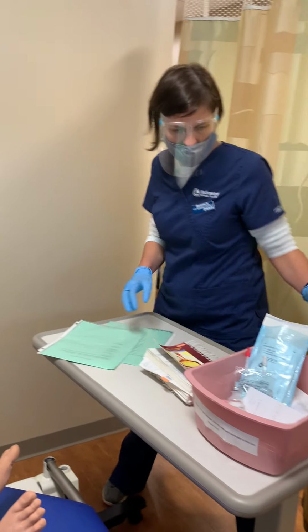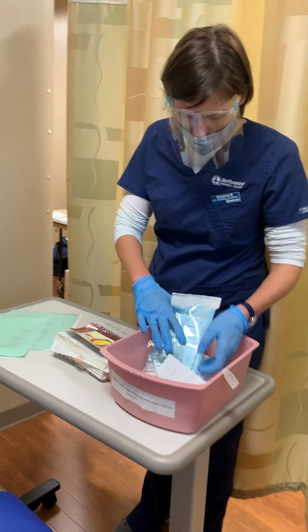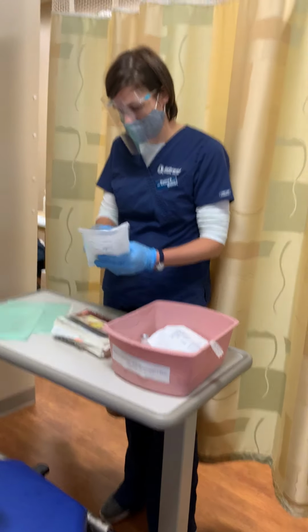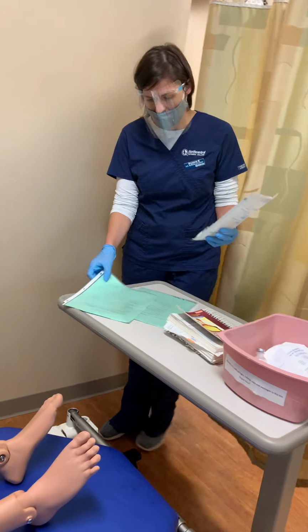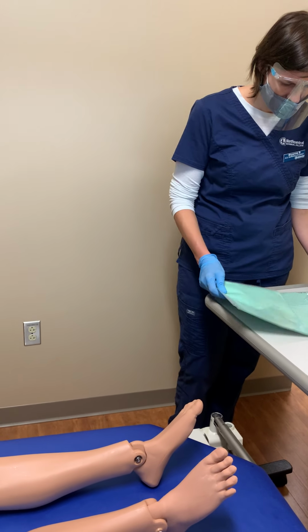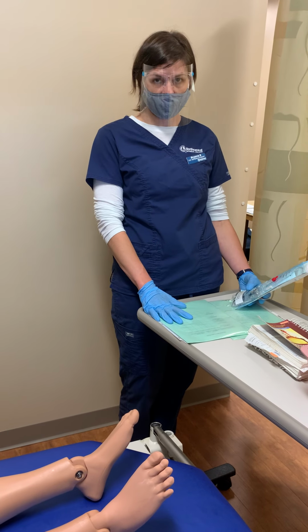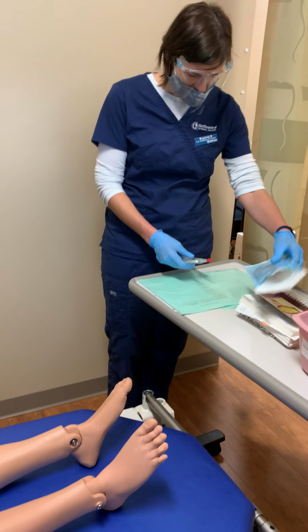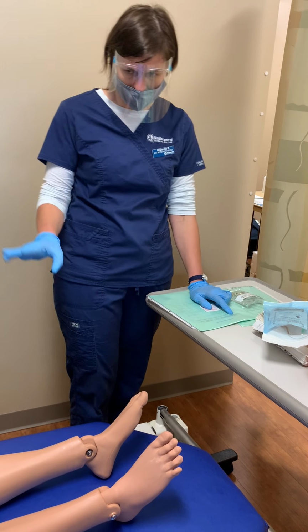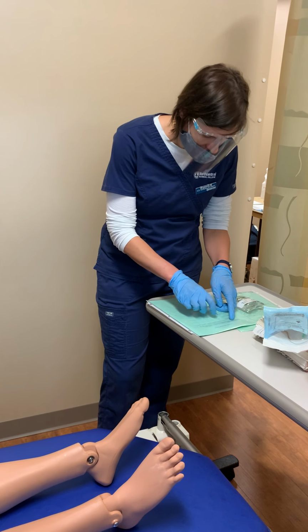So I've done, let's go ahead and clean my hubs. Potassium. And I'm looking at my MAR, and I'm going to do my 5 checks. So I have Frances Christensen, as we've already confirmed.